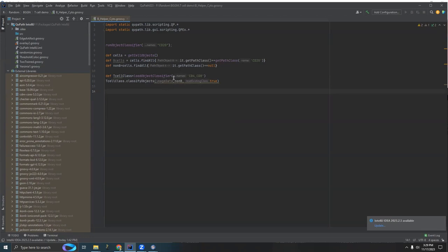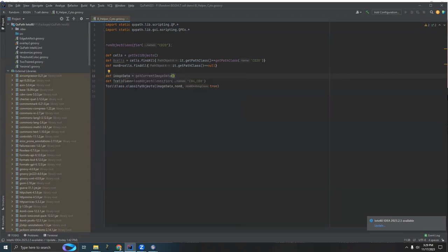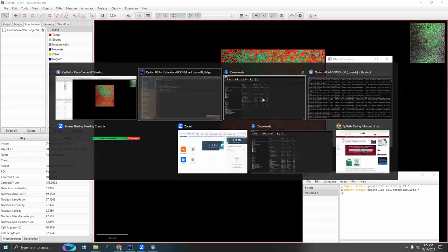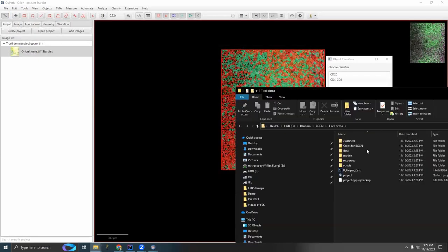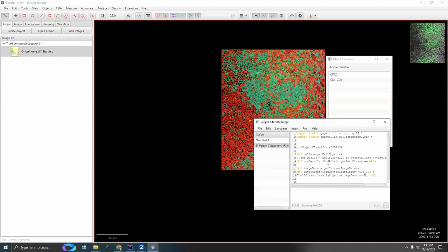So it's telling me that I never actually defined image data. So I'm going to go up one line and define image data equals get current image data. Yay. Okay, I defined the B cells, but I actually don't need them for anything. So I'm just going to comment that out because we don't need it. Let's save this, go back into QuPath, load this file, and run it, see what happens.